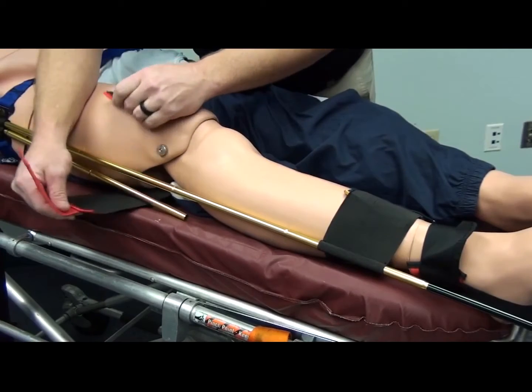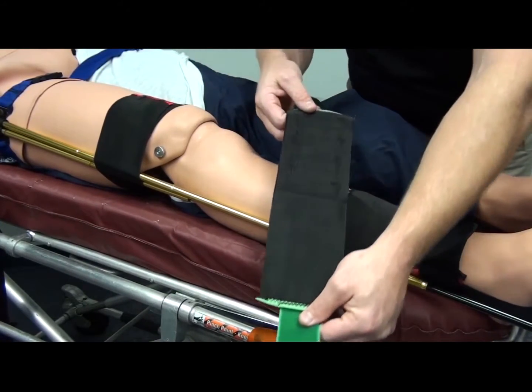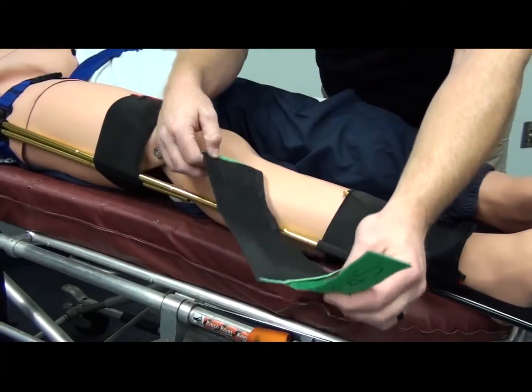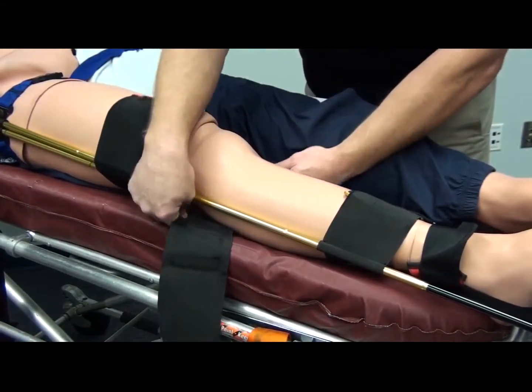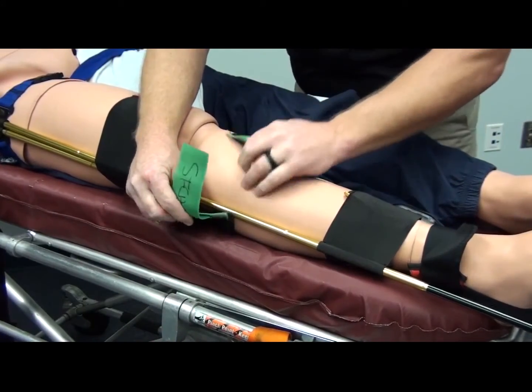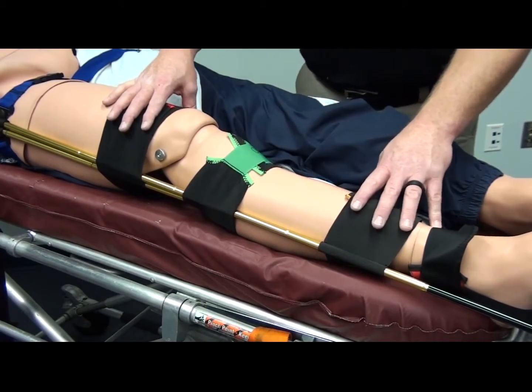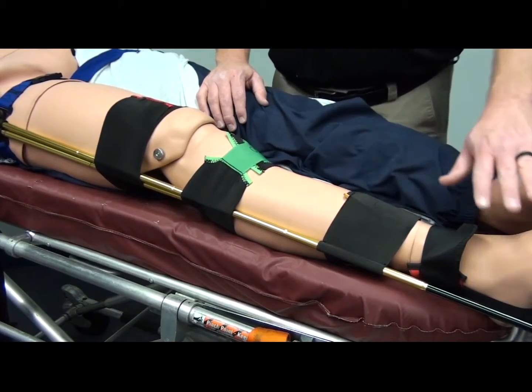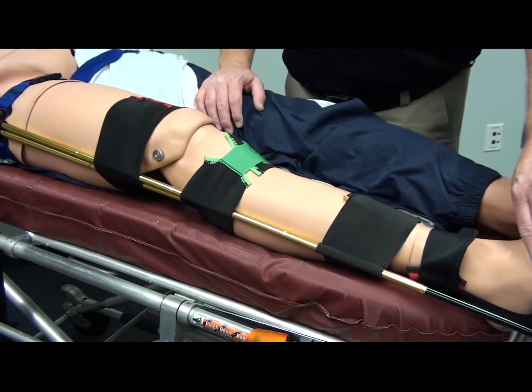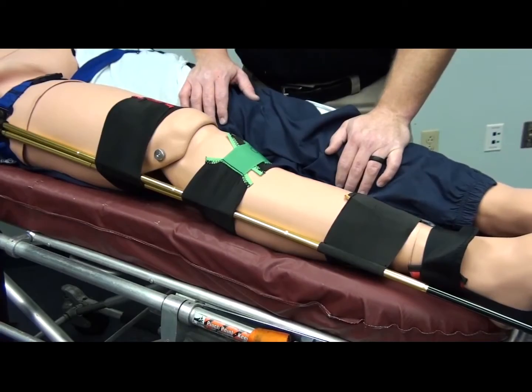Again, we're not moving the leg, we're reducing the amount of movement. Again, just tight enough to go. The green is a little smaller than the red, and it can just go below the knee to secure that device to the leg itself. Once you have secured all the straps, again, we check CPMS before and after all of our patients, ensuring that there is a distal pulse and you have good cap refill.